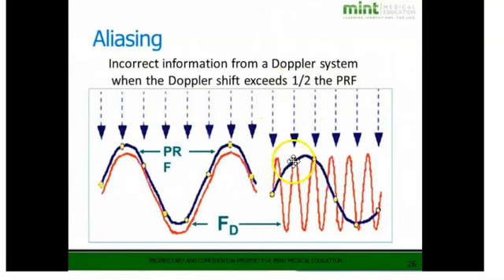And you can see here we can't sample this wave. We need to sample it here, here, here, and here in order to see the wave pattern that's coming back to our transducer. Well, we're only able to sample this wave here, so we're saying this wave looks like this, and it actually looks like this right here. So if we can't sample it, we can't see it, and therefore we don't know which direction this wave is going and what happens on our screen.